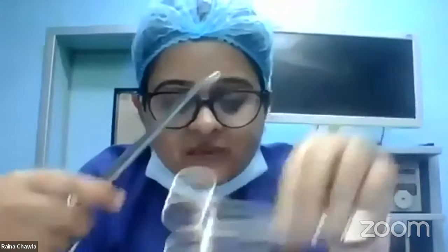Okay, and I need to see the lower uterine segment. So I introduce the Doyen's and I can see the lower uterine segment. Now, the lower uterine segment is covered by the uterovesical fold of peritoneum, which is basically the visceral peritoneum. Perfect. Okay, so I need to open that. So I hold the visceral peritoneum again with an artery forceps. I take my scissors. So I take my scissors. I cut the visceral peritoneum. And now I can see the lower uterine segment.